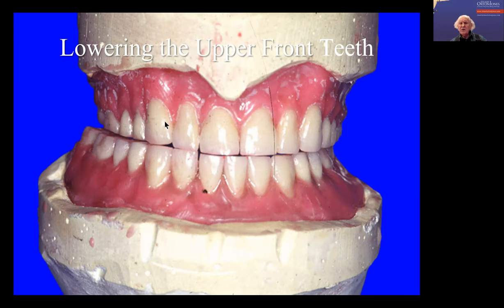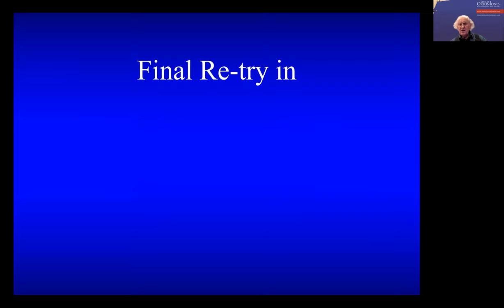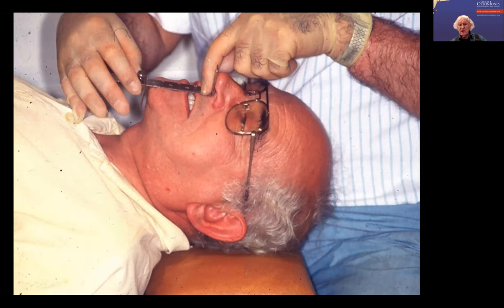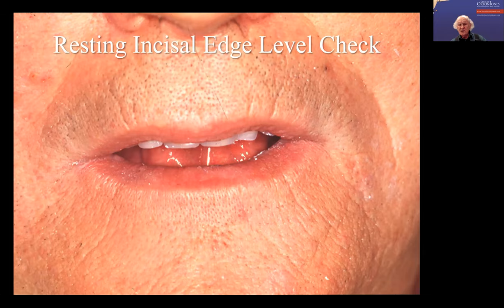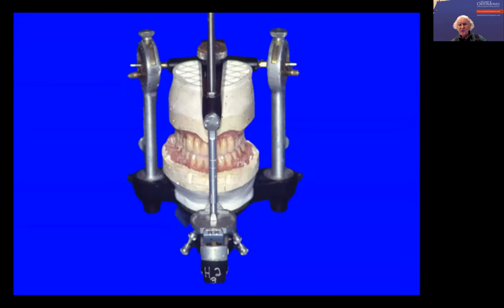Do any of you do this sort of thing yourselves with a lacron carver, heat up the wax, and move the teeth around? I find it quite fun to do. So then we're ready for the next try-in — measuring the vertical dimension, checking the hinge record, checking the incisal edge levels, which are better now. So then we finished the dentures.